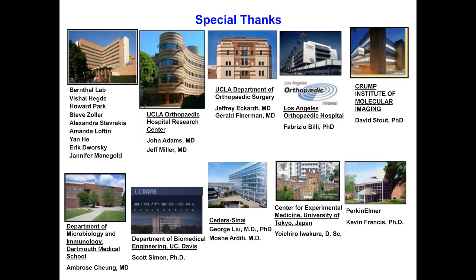So we showed FDG, and using the FDG PET imaging, we're able to actually see the glycolytic metabolism, glycolysis, in the animal tissues or in the tumors or cells of interest. If you're interested in looking at the structures, or for example, if you want to look at how different layers of fat are being affected by treatment, then you can actually use something as simple as anatomical CT imaging and analyzing the different layers. So it really comes down to the question of interest, and each imaging modality or multiple imaging modalities may be able to answer the same question or complement each other.